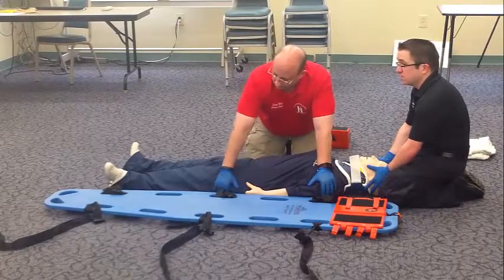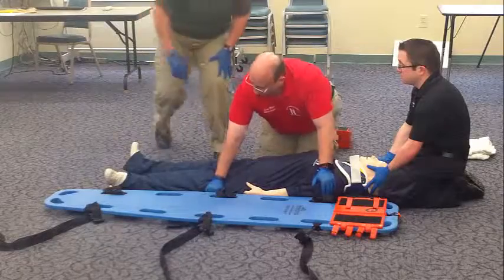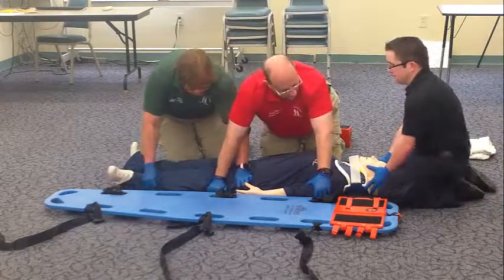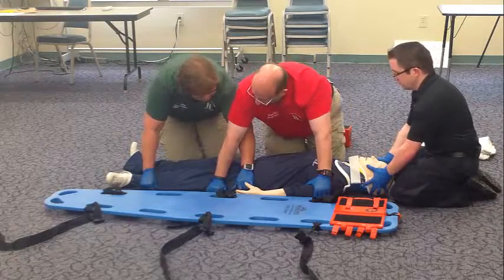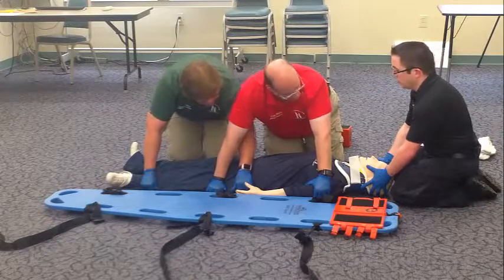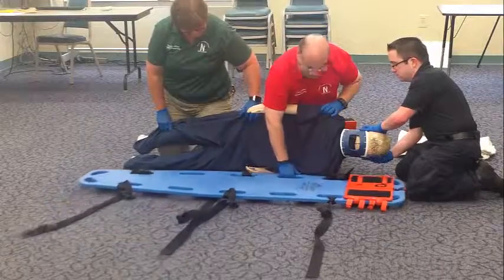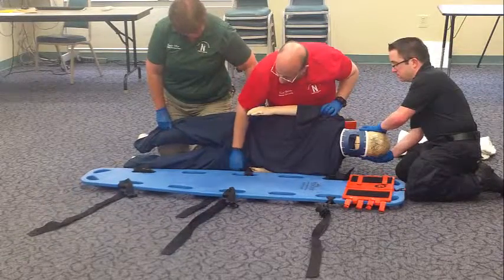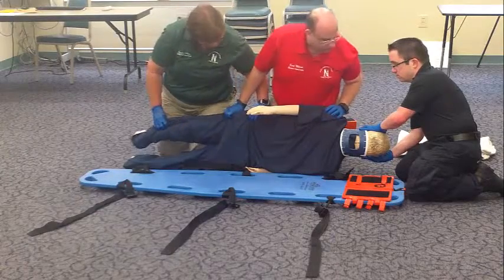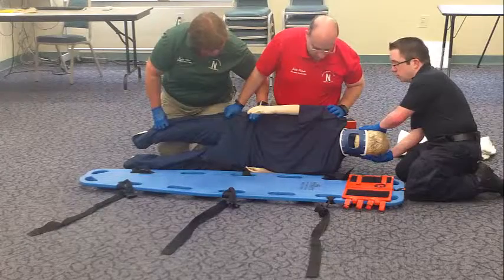I'll direct my partner on hand placement: place one hand here and one hand here, please. On the head person's count of three, we're going to log roll the patient past the 90-degree angle towards us. One, two, three. Position the spine board, checking the straps so they don't get trapped underneath. Now we're going to log roll as a unit back onto the board. Ready? On your count. One, two, three.